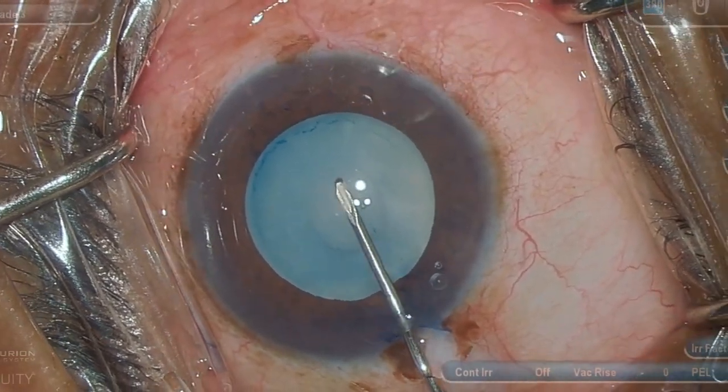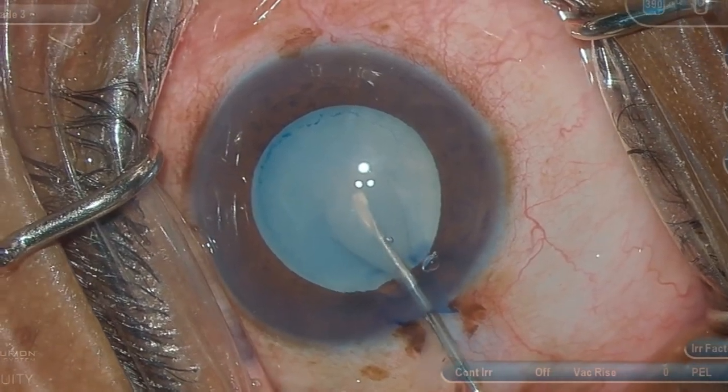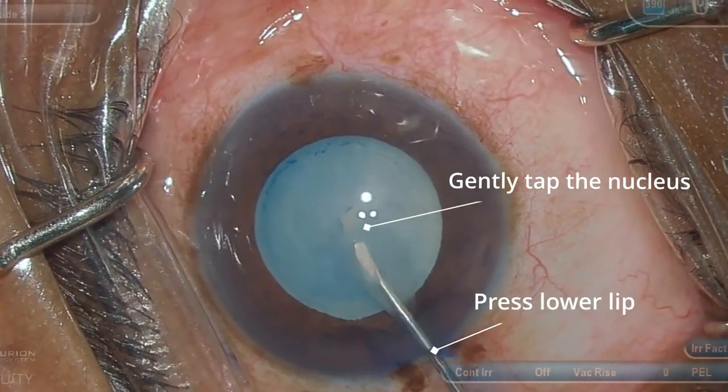With the help of a cystotome, multiple nicks are made in the central 3 mm zone of the capsule. The milky fluid is expressed by gently tapping on the nucleus and by pressing the lower lip of the tunnel.